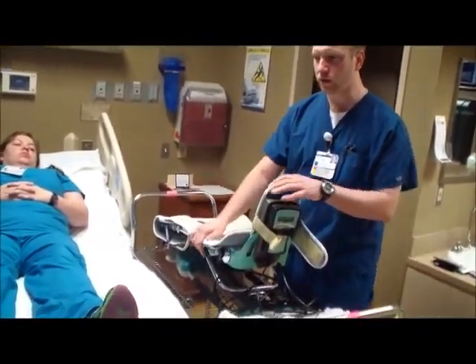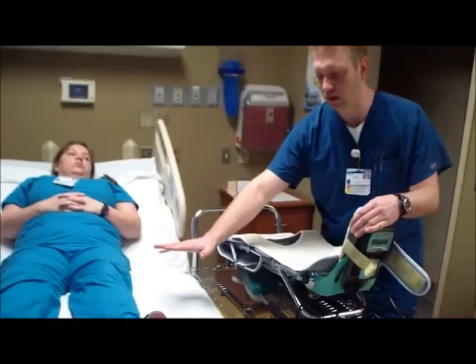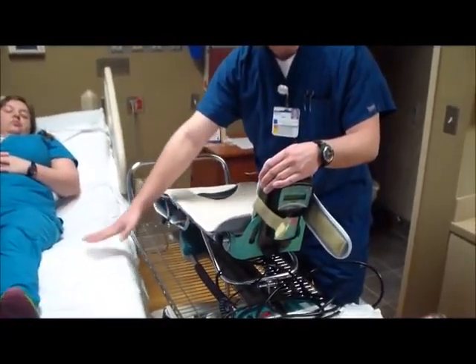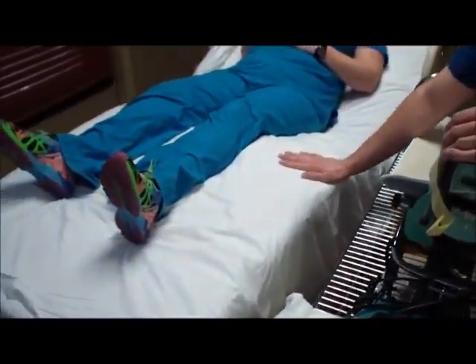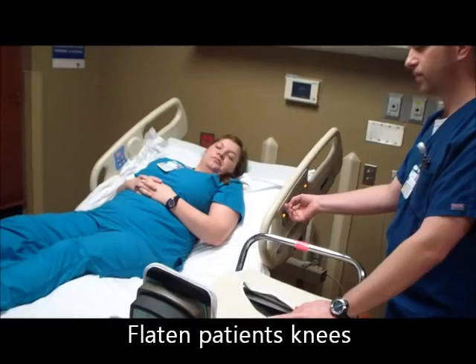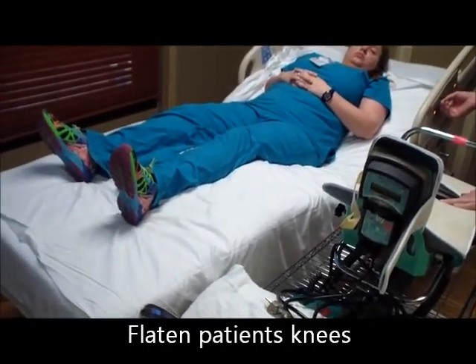So when you come in, you're going to want to notice a whole bunch of things. Okay, is the lower half of the bed where the patient's knee bends, is that flat? As you can see right here, her knee part is not flat, so we need to flatten that before we progress any further.